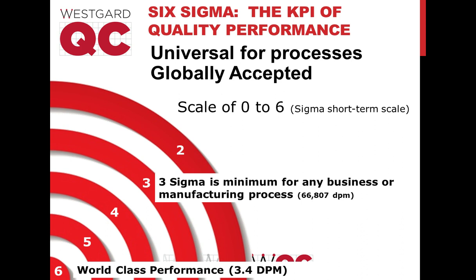Okay, because a warning rule is not a rejection, and for most of your warnings, you're going to end up clearing it anyway. So whether you turn a rule into a warning rule is really more about your own time management. You just want to make sure you're not picking warning rules that go off so often that they're really just a distraction.